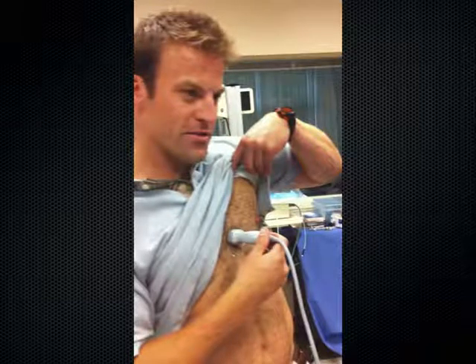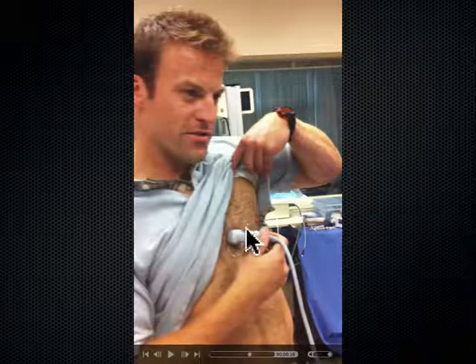So that's Eric Mervis. He's one of our residents in the emergency department, and when I first saw him do this, I thought, wow, does he just have really wide-spaced nipples? Because look how far apart the probe is from his nipple. But he doesn't. I looked for a web neck and other signs of chromosomal abnormality. He doesn't. It's because he's standing up, and the heart shifted in his chest cavity a little more medially.